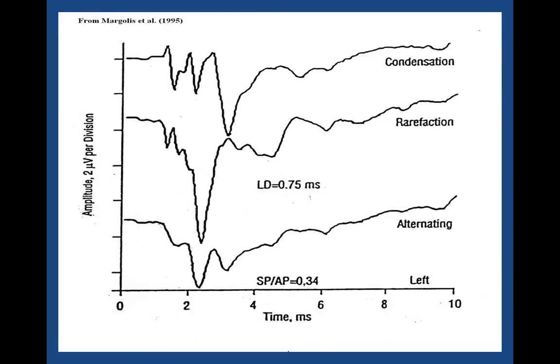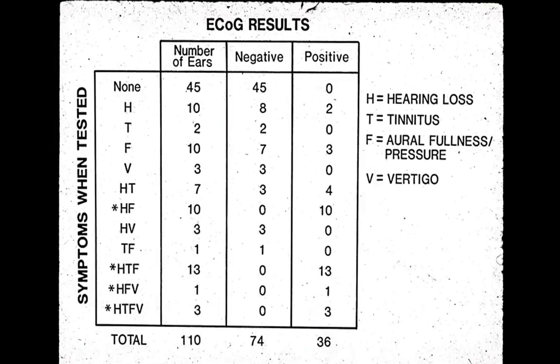When I brought this to the attention of my physician colleagues, they said, yeah, but this gives us objective evidence. This gives us something that I can use to justify a treatment regimen. It gives me something, almost more importantly, that I can take into court and say, see, this is why we did it this way. So regardless of that, it is an important objective tool for monitoring hydrops.